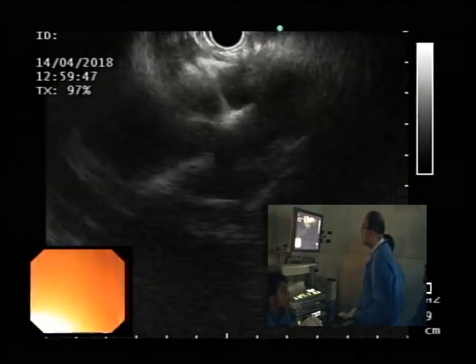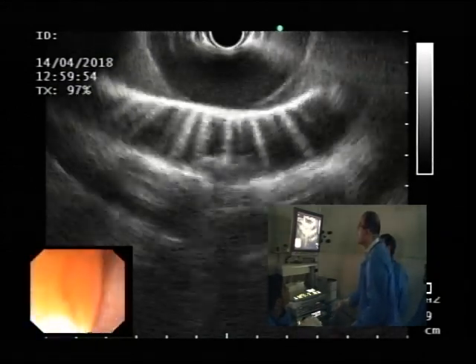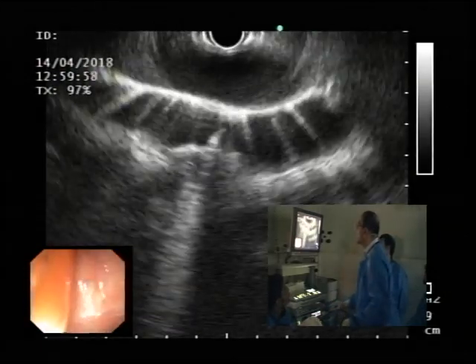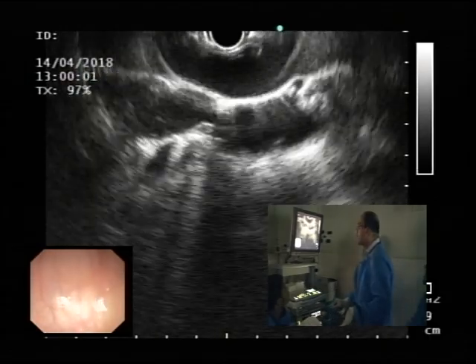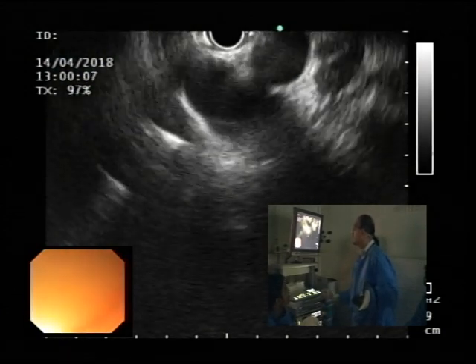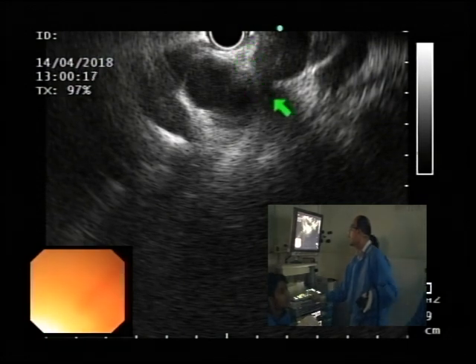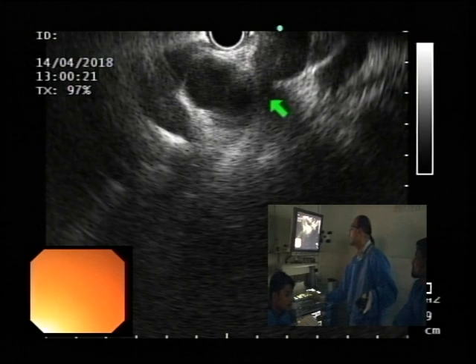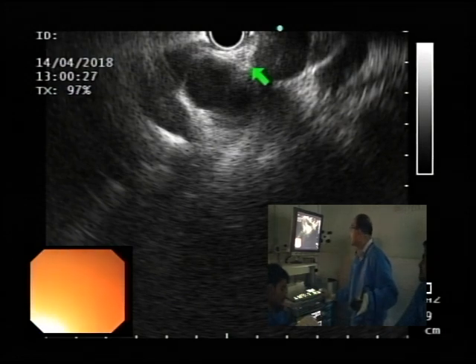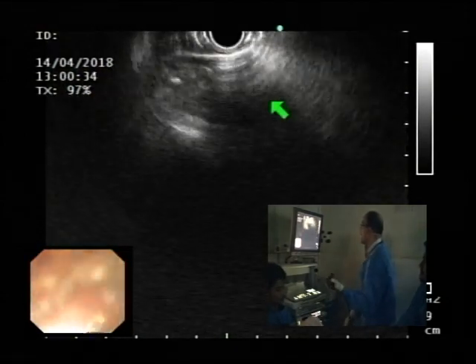so that's the trachea. Sorry, let me just go counter. That's the aorta. You can always do 360 all the way as you pull back, but as you come back towards the arch, thumb down, and go clockwise, you have what's called the left lower paratracheal region. So you have aorta, pulmonary artery, 4L, left lower paratracheal, and 5, which is the aortopulmonary window. These we can obviously sample quite easily. Here you have vessels in the way. Those are the two main areas where we look for nodes.